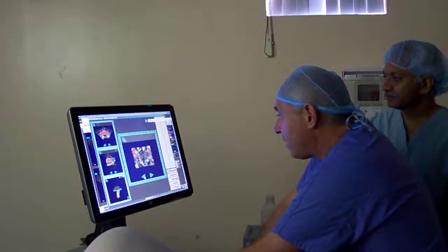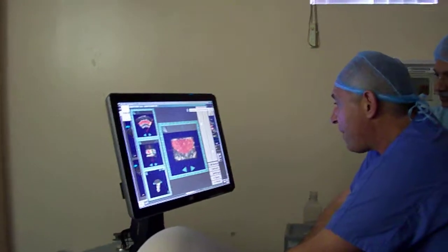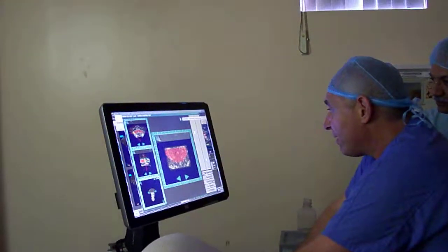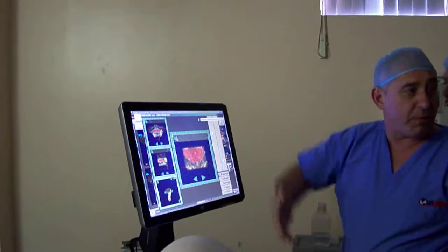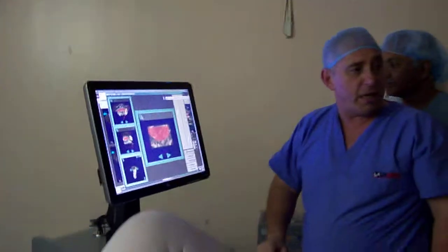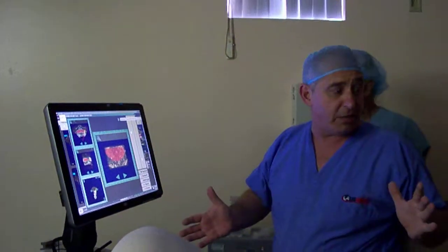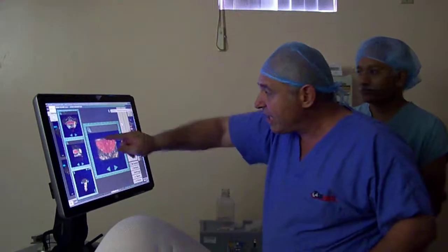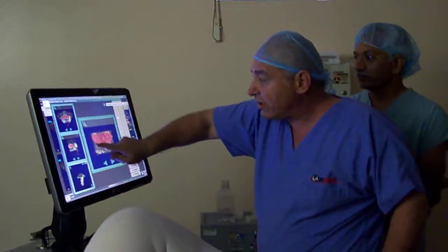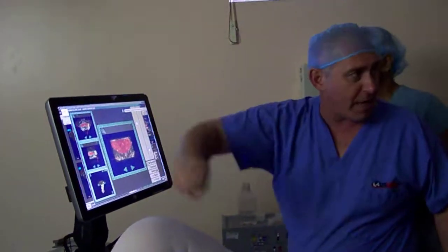So if we look at this, I'm looking at the different images. I want to make sure I've got the prostate covered. Now we can say, okay, maybe that's excessive there, maybe there. But I've confined that treatment pretty accurately to this entire prostate. I've got the whole prostate covered. And conversely, I don't want to be way outside either, unless you had disease out there you wanted to treat. If you had bulky disease out here, we can tell the computer to deliver energy outside of that prostate, or to hit the capsule, an area outside of the capsule.